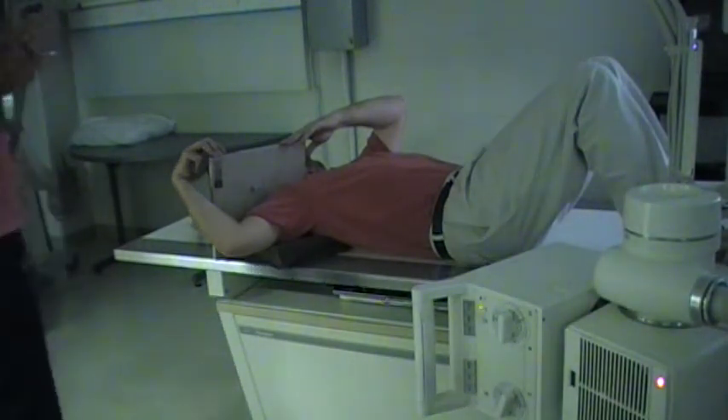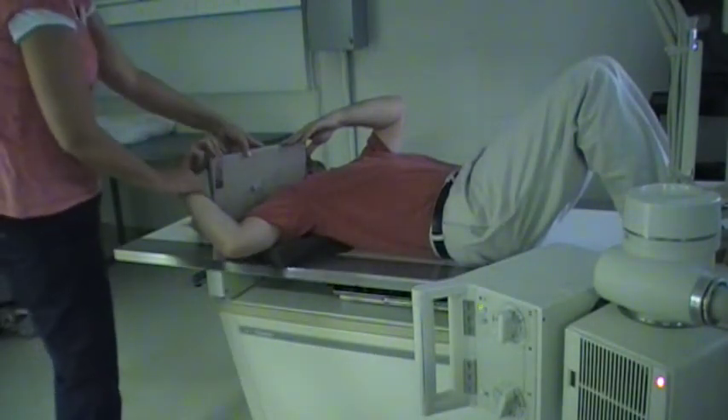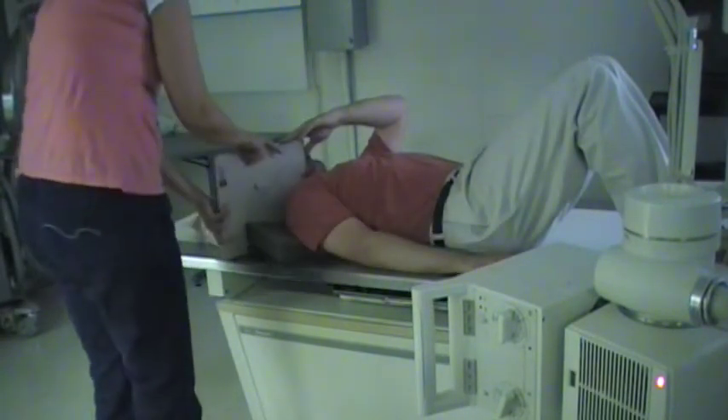Next I'm going to show you the tangential method for the intertubercular groove. That's evaluating the groove or depression in between the two tubercles, where the biceps tendon actually runs through that groove.